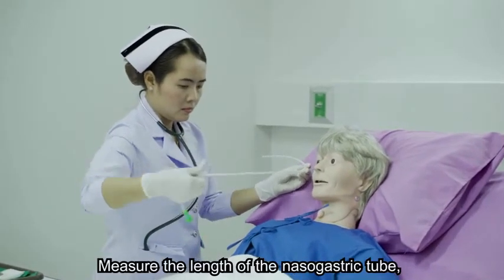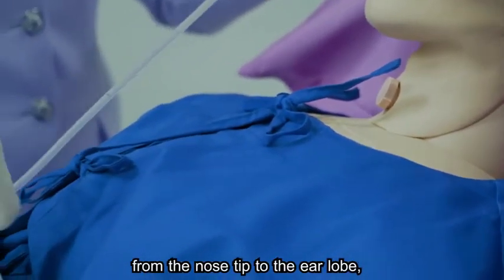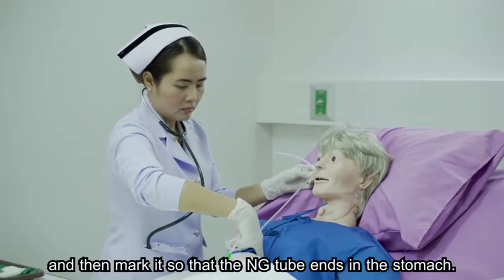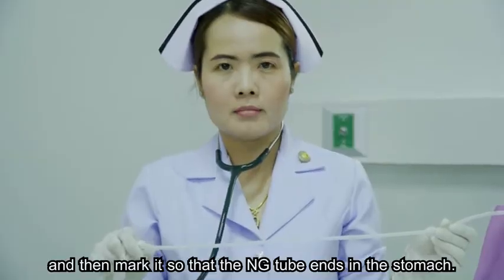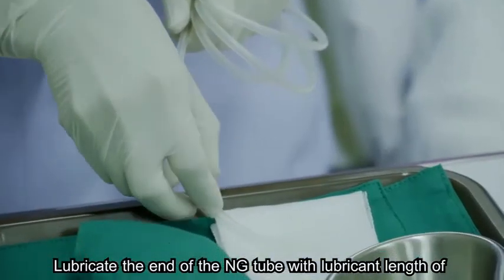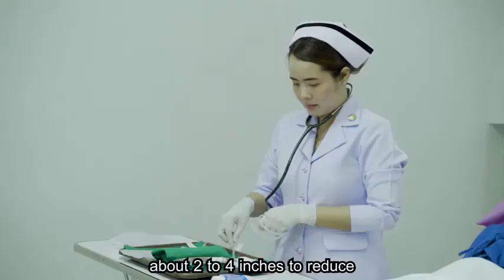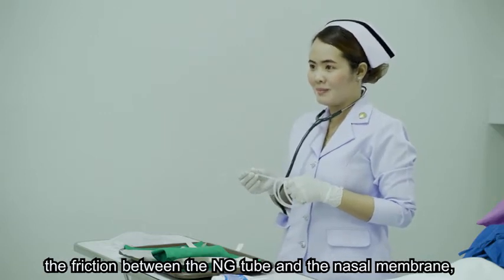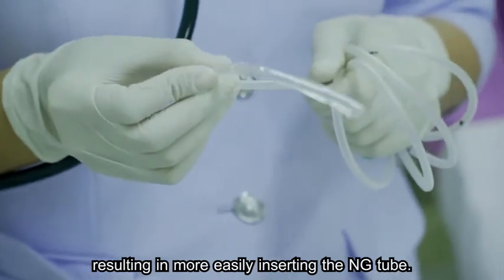10. Measure the length of the nasogastric tube from the nose tip to the earlobe and from the earlobe to the xiphoid process, and then mark it so that the NG tube ends in the stomach. 11. Lubricate the end of the NG tube with lubricant for a length of about 2 to 4 inches to reduce the friction between the NG tube and the nasal membrane, so that the NG tube is inserted more easily.